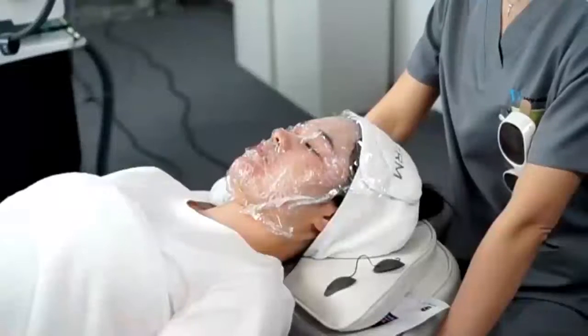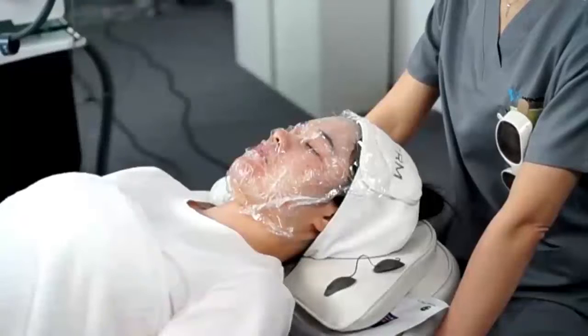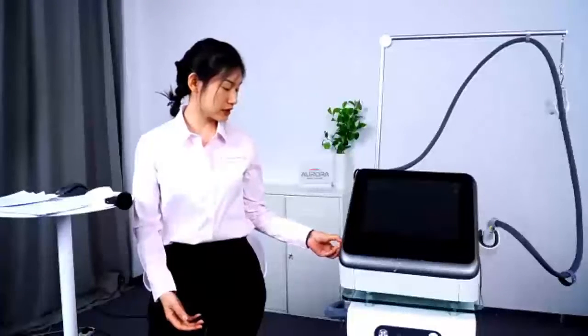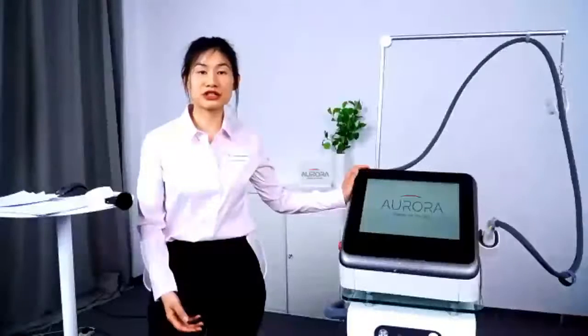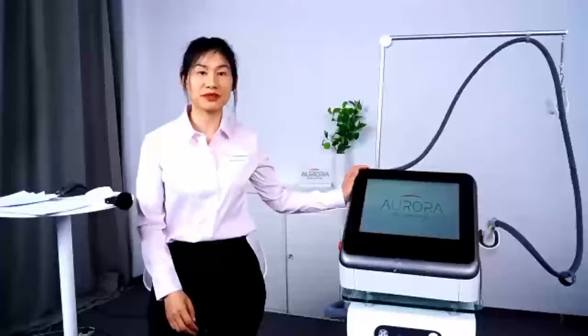For the clinical treatment, our model has already done the anesthetic. And now we'll show you the device here. Let's press the power button and release the emergency stop. The system will take around 30 seconds to enter the interface.